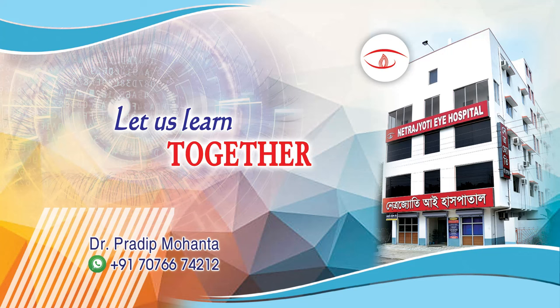In this video, we are going to learn SICS, Small Incision Cataract Surgery.